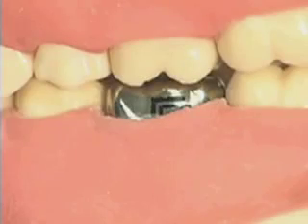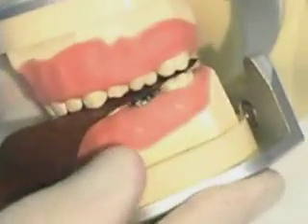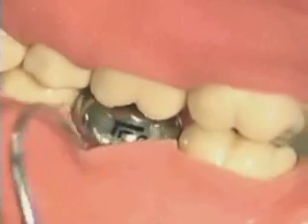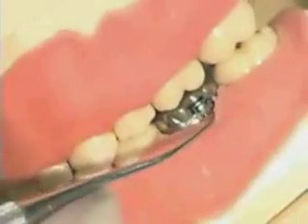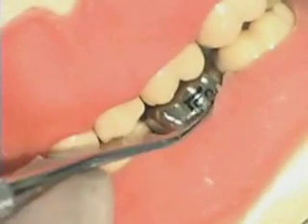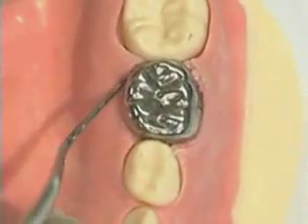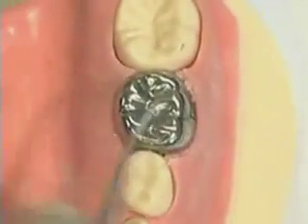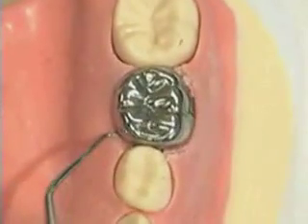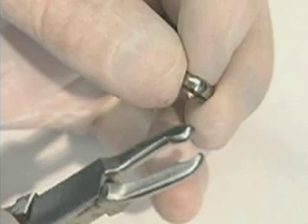Return to the preparation and reseat. Position it back in the typodont and check the occlusion using articulating paper — the crown is in occlusion. Gingival length is 1 mm below the free gingival margin. Now test adaptation by taking the tine end of an explorer and feeling below the free gingival margin to determine if there are any open margins — buccally, lingually, and proximally. Note that you should not be able to lift the crown with the explorer. Since I can, it means our marginal fit is not tight enough. Marginal adaptation over height of contour provides retention, not cement.